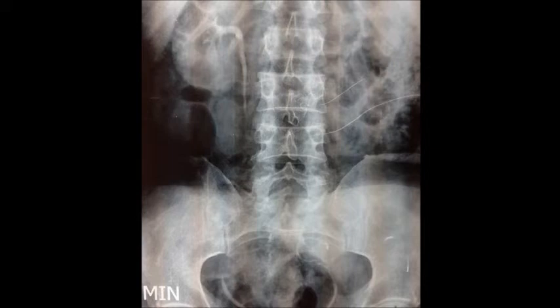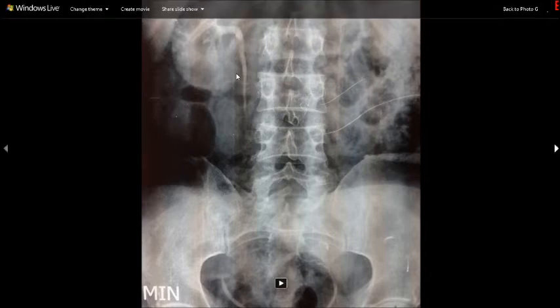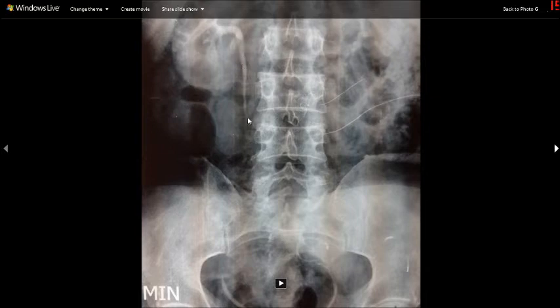Here in this IVP, you can see this is the kidney and pelvis, with the ureter coming to the bladder.